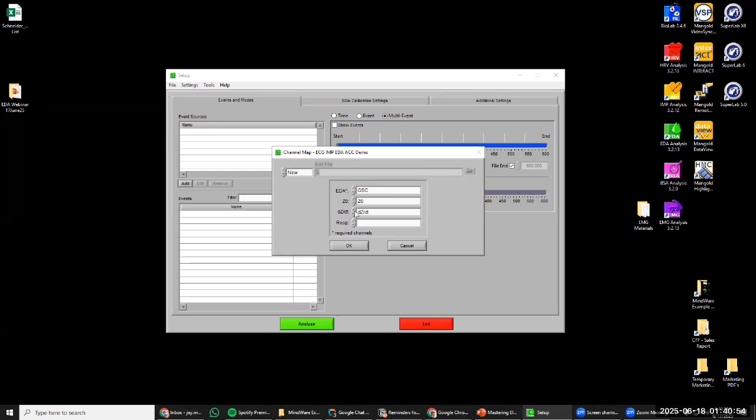here. One important thing that we're going to look at in a little bit is that we do have these skin conductance responses, which can be purely psychological in nature. One problem with this is that our respiratory system is very thankfully innervated with our sympathetic nervous system. But one of the problems when looking at SCRs is that we can actually have respiration-driven skin conductance responses. So if we breathe in deep enough or we have a very large sniff, 1 to 3 seconds later, we can actually see an SCR occurs.